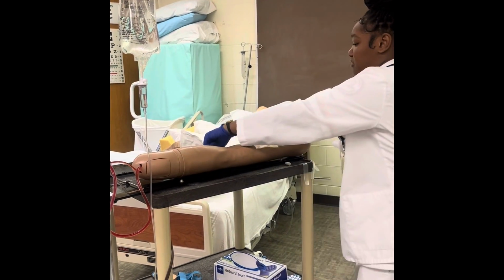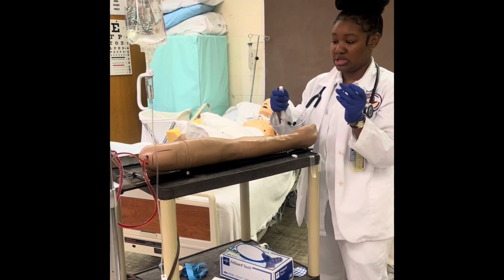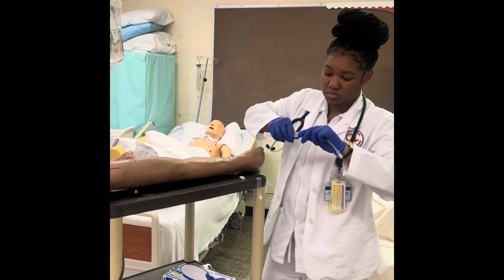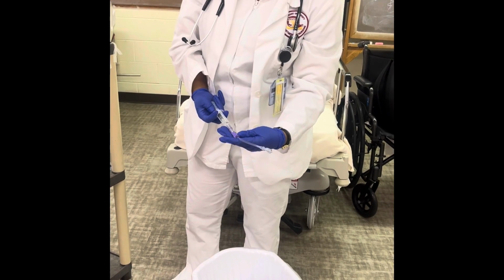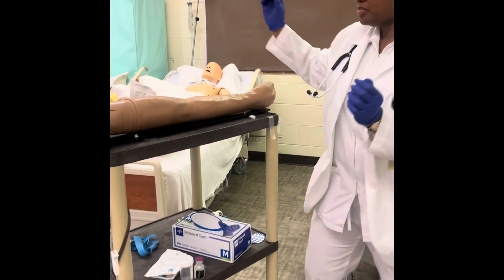Okay, and before I begin, I can go ahead and do my saline lock, which is just priming the tubing that's going to be connected to my IV. Make sure to unclamp it, if that is unclamped, and get all the air out. All right, put that to the side for now.